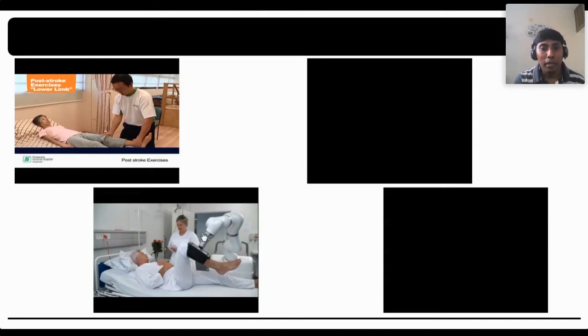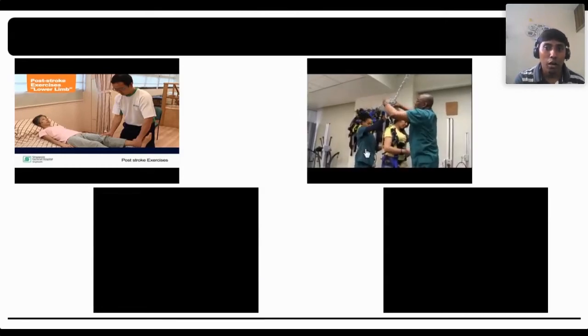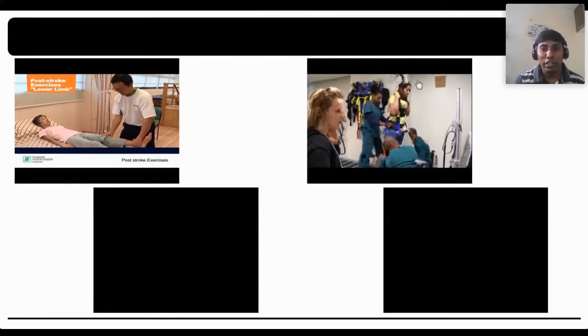But on the other side, there is the ground based system, which is for gait training. For example, you can see the manual training required at least 2 or 3 assistants to do the treadmill gait training. Right now, she is hanging on the overhead support, and we see that these two people are trying to push her leg on the treadmill, and this lady is supporting.